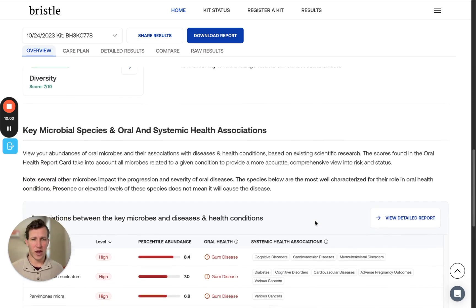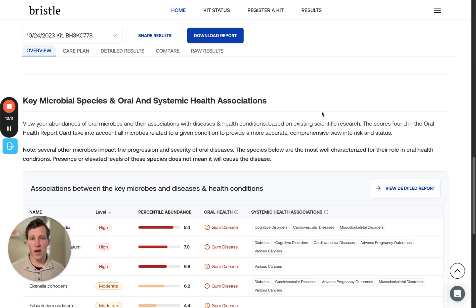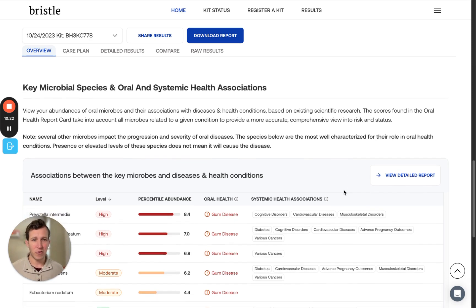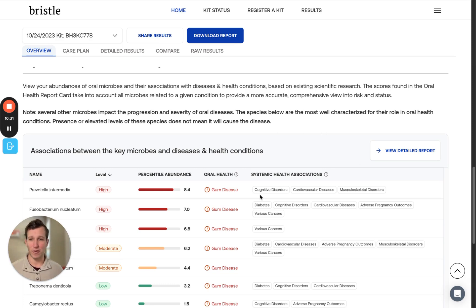As we continue down, you'll see that we have the oral and systemic health associations feature. Note that presence or elevated levels of these bacteria do not mean that they will cause disease or that you have the disease. This information is presented purely to help you understand if you have any bacteria that have been associated with systemic health conditions, so you can proactively address them and be aware of the impact they could potentially have on your oral and overall health.